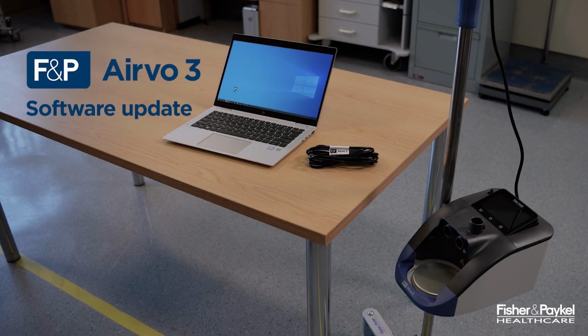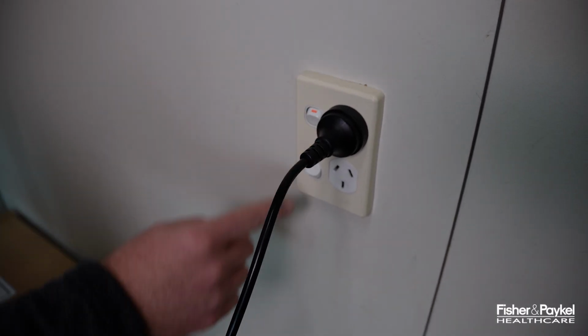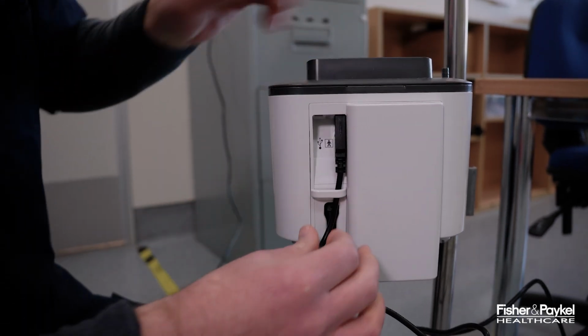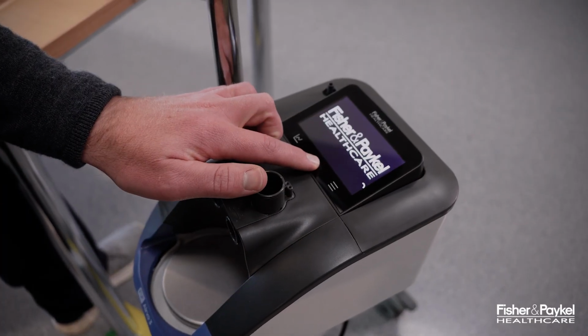Now that you have the Device Manager application installed, you are ready to check and update software. First, you'll need to get the equipment ready. Connect the Airvo 3 to power using the power cable. Connect the Airvo 3 USB cable to the back of the Airvo 3 and the USB port of your computer. Turn on the Airvo 3.